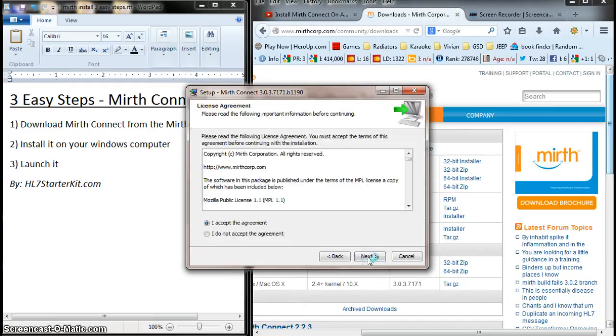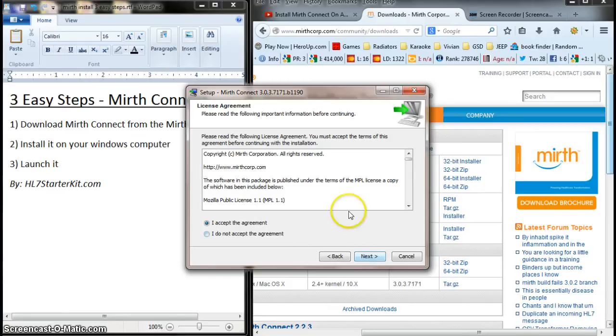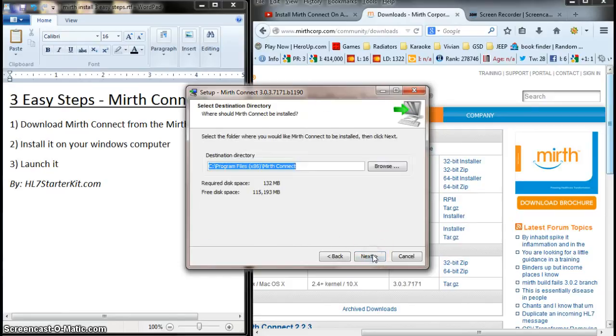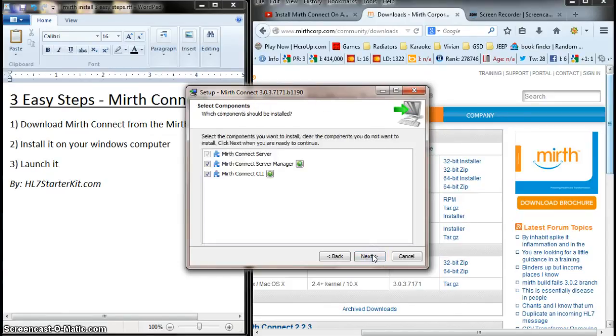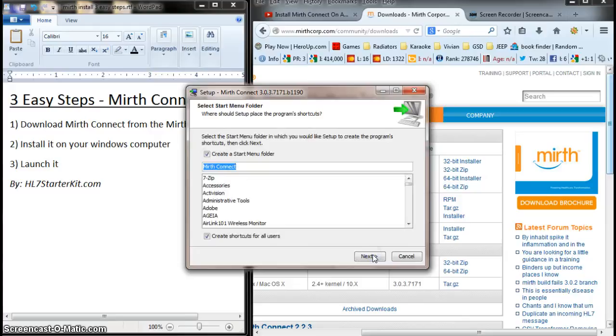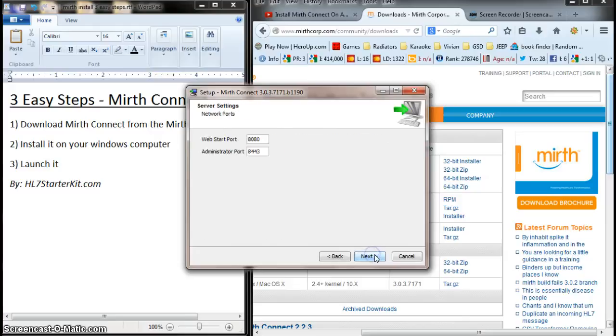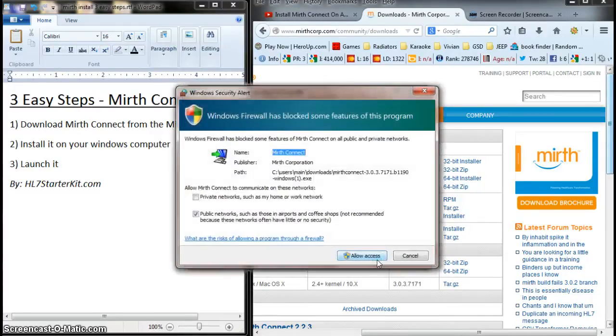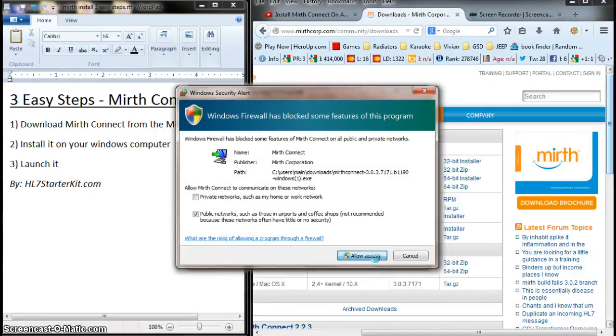And here's the wizard. Now, I'm going to accept all defaults. Here's the agreement. Here's the path. I'm just going to click Next. Default port. Next. Windows. Yes. Allow access. If you get these prompts, just allow everything.